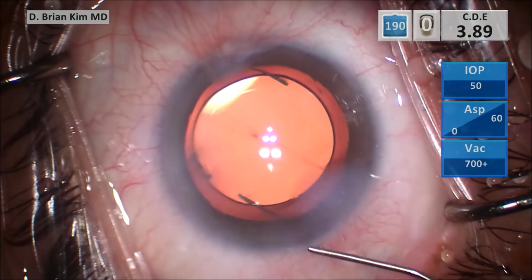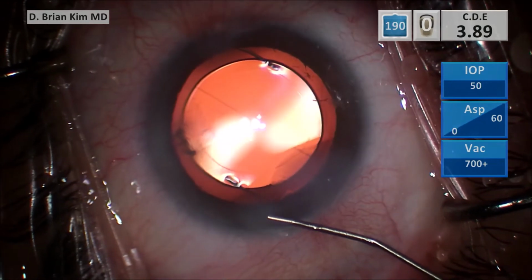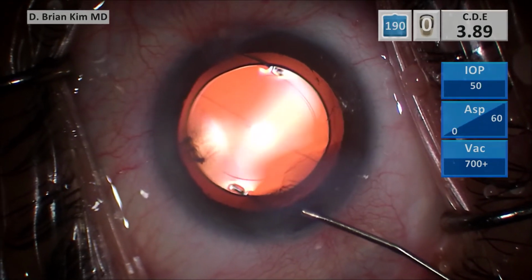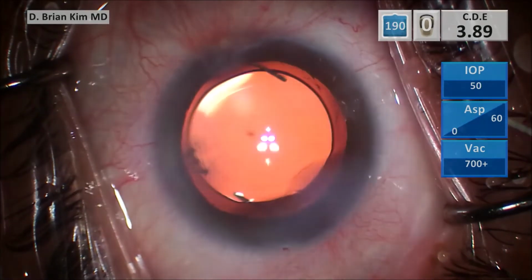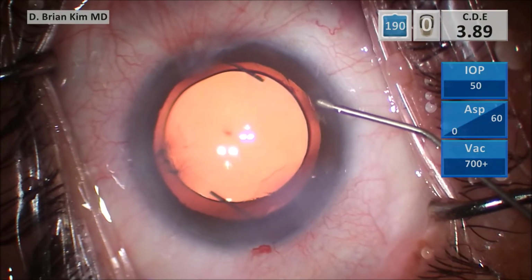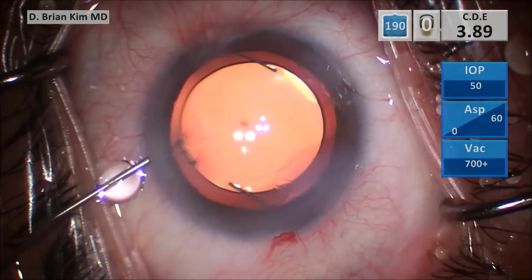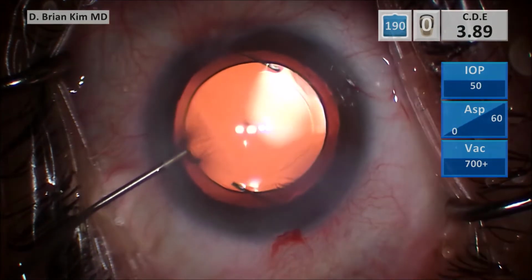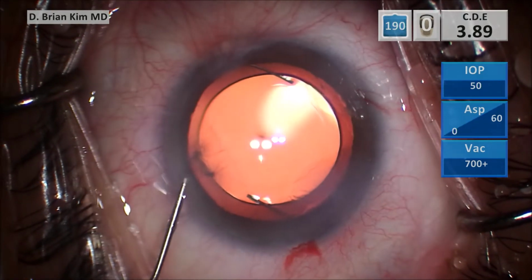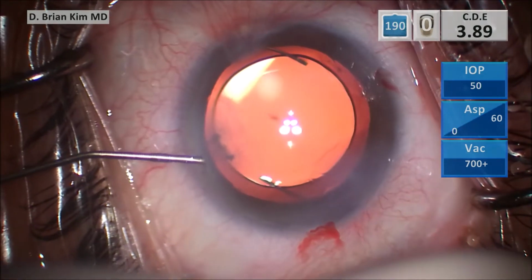But of course, you don't need an instrument for this. And so you save money for the patient, for you, and you don't need extra instrumentation. You don't need any extra skill. You just have to use your chopper and the phaco tip, but use it in a different way, the way you've never thought of, using the phaco tip as a chopper as well as a chopping block, because you can chop the lens material with the chopper against the phaco tip from any which angle.